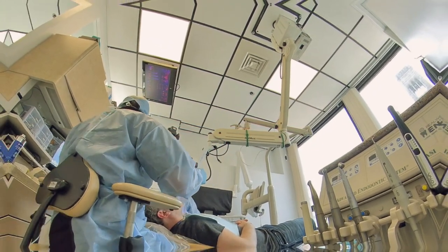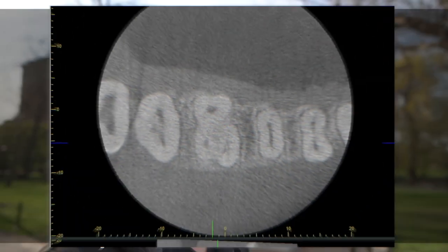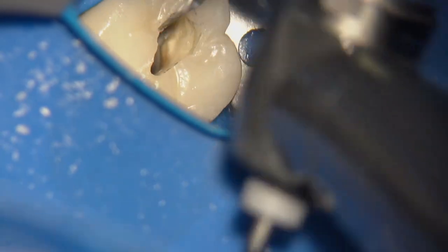Then we got inside the tooth — a little difficult to see with the shield — looking for the MB2. I knew from the CBCT it was going to be an oval canal with something going on at the apex. My philosophy for now is going to change: I'll use a little bit larger taper and larger access preparations to facilitate both instrumentation and irrigation, as well as obturation.